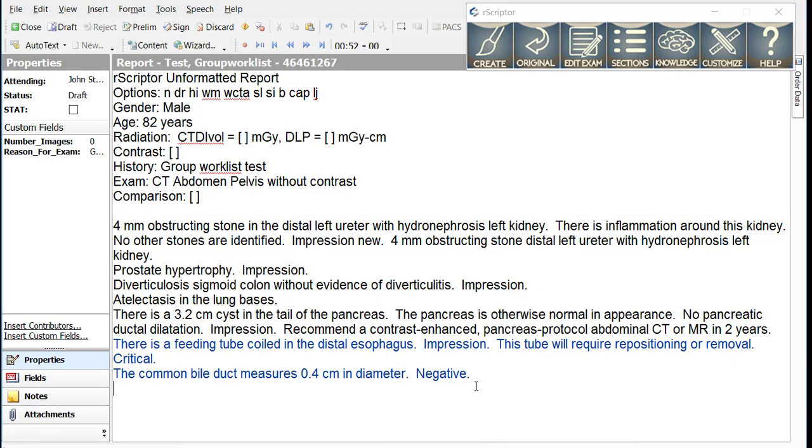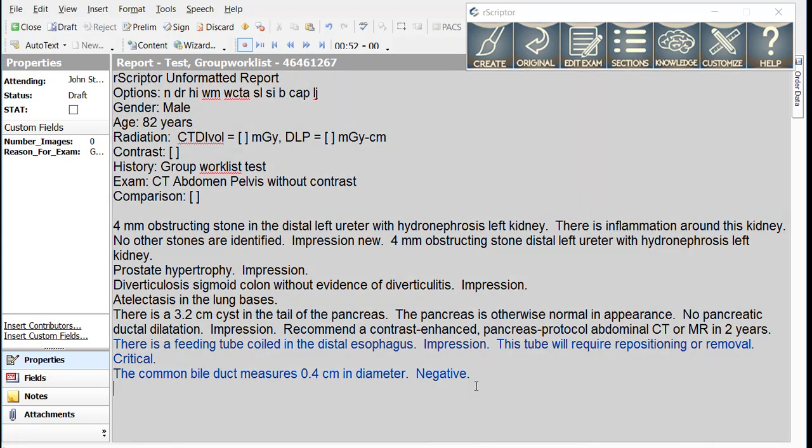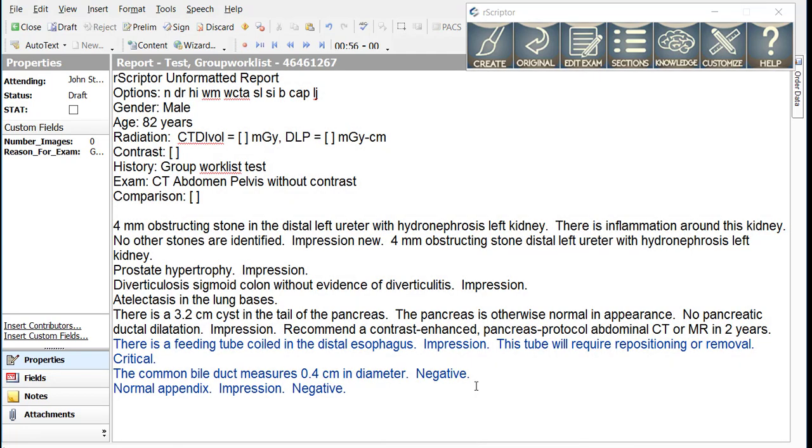New line. Likewise, if you have a pertinent negative that you want to include in the impression, you would also add negative to that statement. So let's assume that the indication for this exam was right lower quadrant pain. So after locating the appendix, I would dictate normal appendix period, impression period, negative period. By doing this, I tell R-Scripter that I want the statement normal appendix put into the impression and I also want that statement classified as a negative statement.